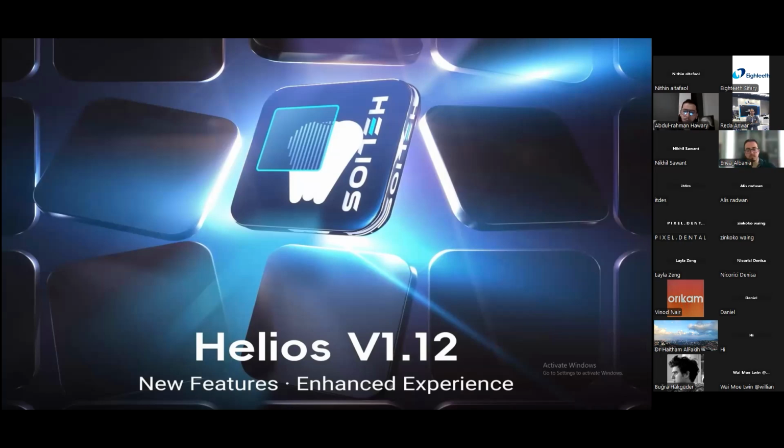So mostly today, I'll be first of all letting you know all the updates, all the new features that are available. Then I'll have a quick software walkthrough showing you how to use these new features and these new updates. So it won't take long. It's a quick session, and I hope it will be a beneficial one.